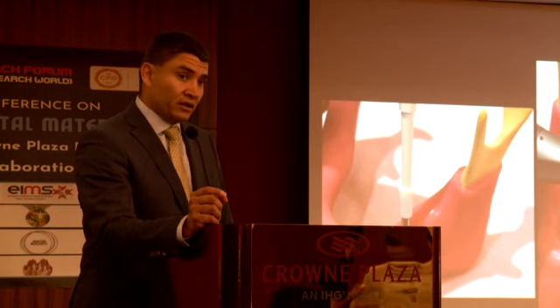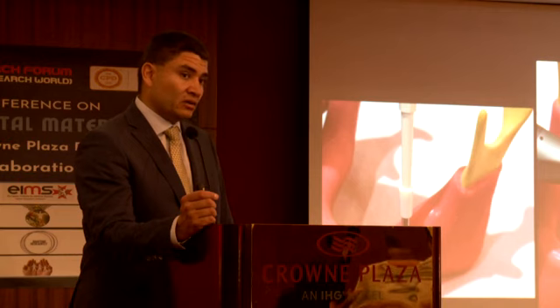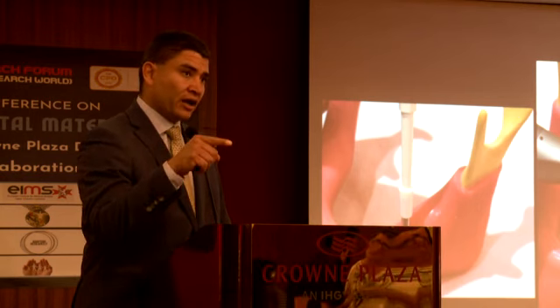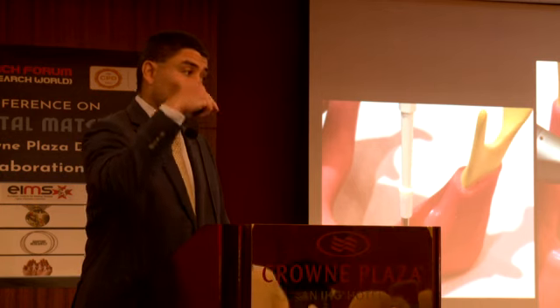If you were to try a very low setting in a regular drill system, the drill that you use in your regular setting is not going to penetrate the cortex of bone. So it's going to be very hard to penetrate. With these drills, called bone blades, even at low setting, you will be able to penetrate.